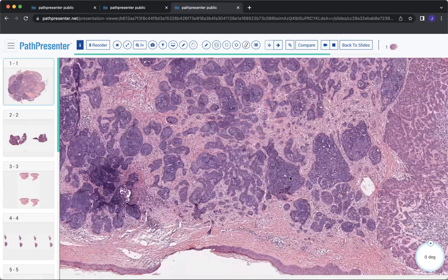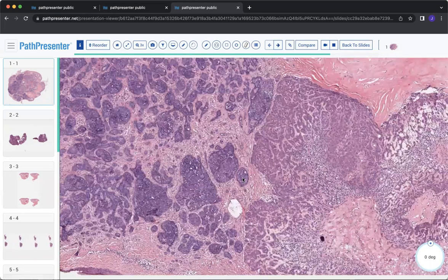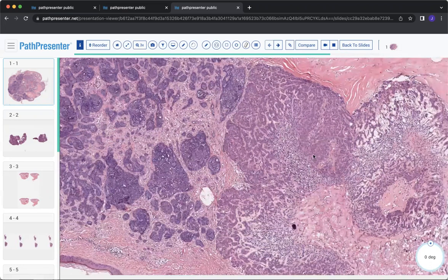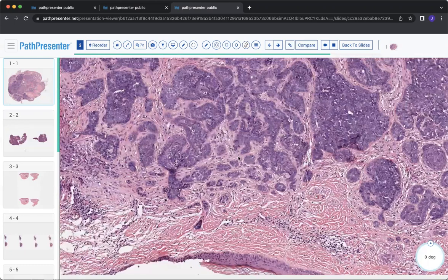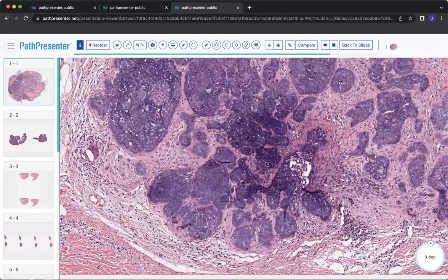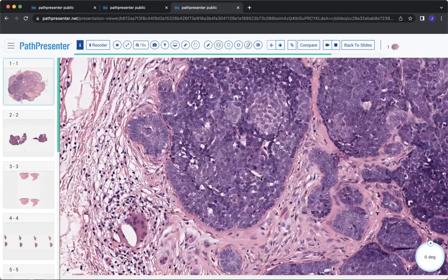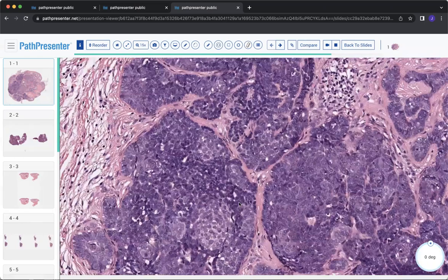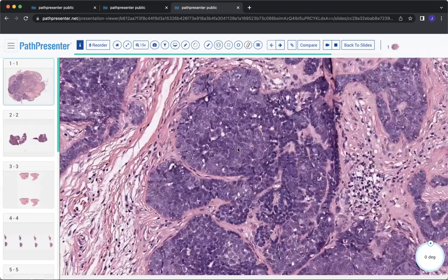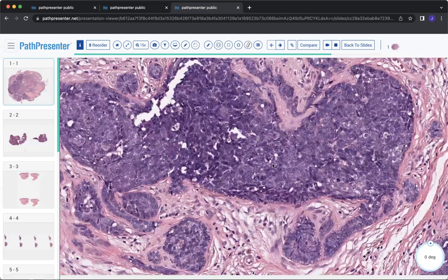So when we think of things like trichoblastoma or trichoepithelioma, a basal cell is essentially just a malignant form of those entities. A trichoblastoma, which is what this entity is, is the most primitive form of a trichoblastic differentiated cell. So you get these cells that are really blue. They take up a lot of hematoxylin. If they were to differentiate, they could eventually become a part of the hair follicle, but they're in the most primitive state here. Trichoblastomas can get very large.